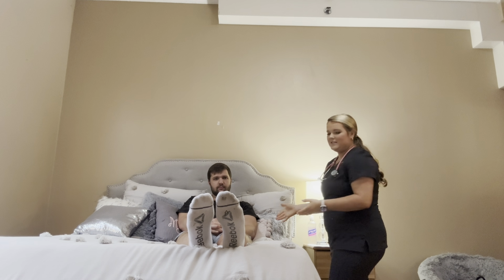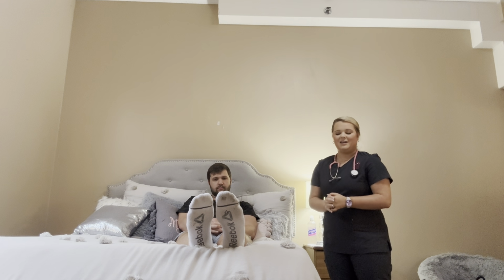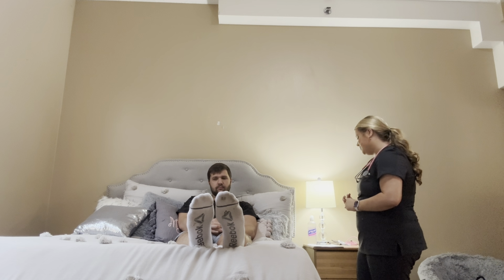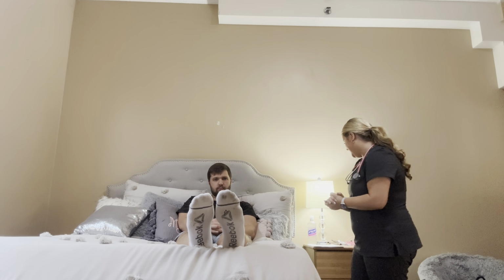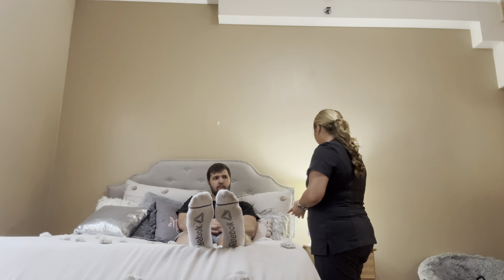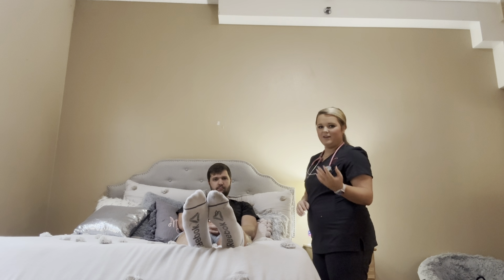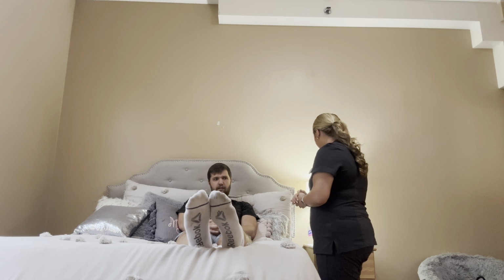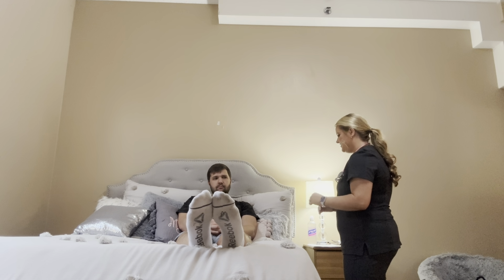And Logan's temperature is 98.7, his heart rate is 82, his respirations are 16, and his pulse ox is 99, and his blood pressure is 124/86. Okay, Logan, are you experiencing any pain today? No, ma'am. Could you rate your pain on a scale from 0 to 10, with 0 being no pain at all and 10 being the worst pain you've ever experienced? 0.